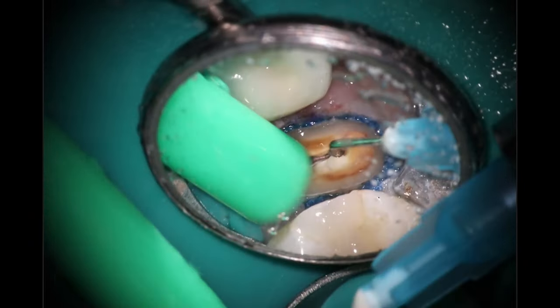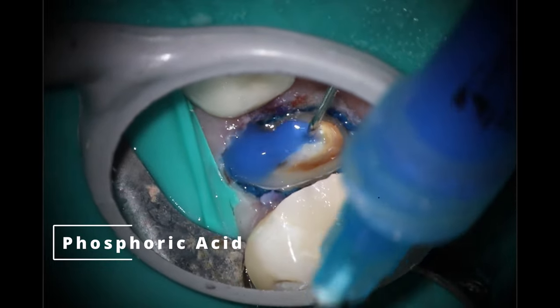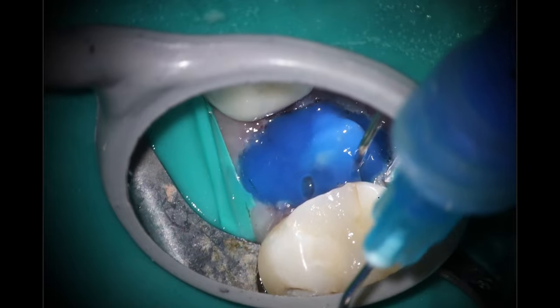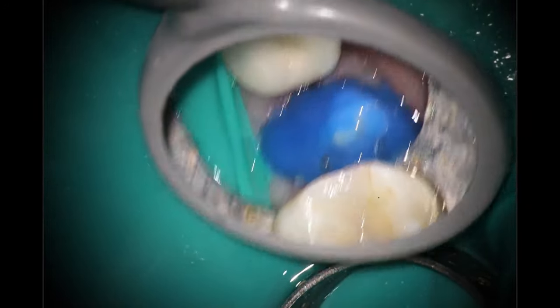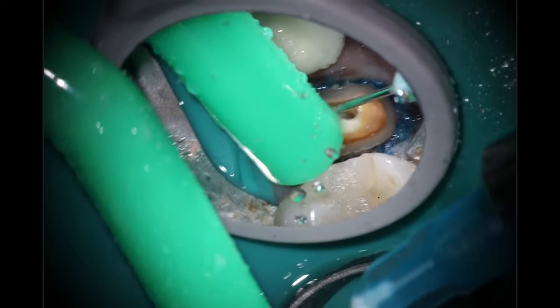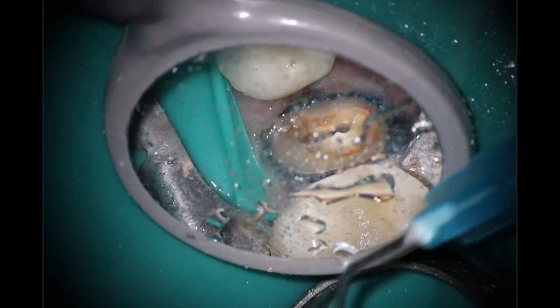I've been using this disclosing solution for about a year and a half, and I'm always astounded by teeth that look like they'd be really bad but have very little bacterial activity, and vice versa. Going in with total etch technique, getting this all cleaned out. I do use ClearFil SE, so it does have the self etch in there, but after talking with a bunch of restorative gurus, this multiple-bottle total etch with self etch inside seems to be the best. That will probably change — this is 2023, so if you're watching in a few years and I'm completely wrong, just make sure you don't quote me without dating me.